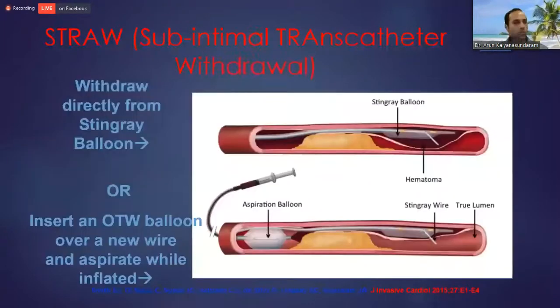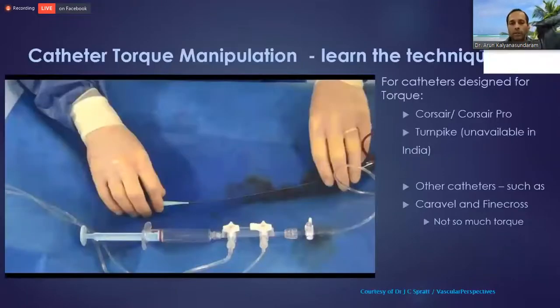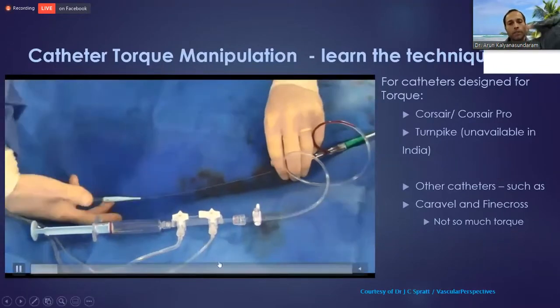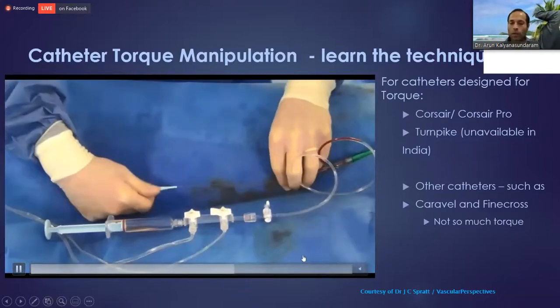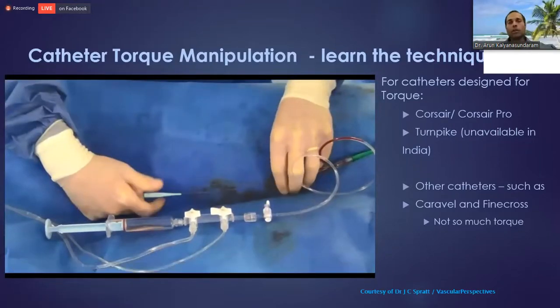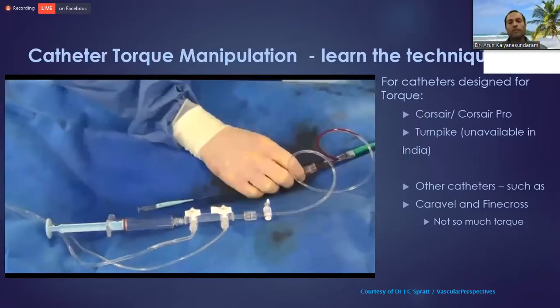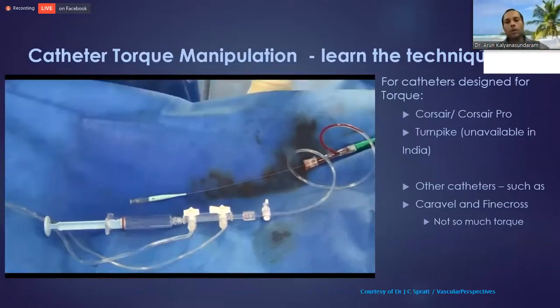So again, a straw is something if you have hematoma. But now, I do know that there are some retrograde operators. So I think it's important to know which microcatheters are torqueable and which are not. Understand that Corsair actually torques better counterclockwise, but you've got to go a couple of rotations, typically 5 to 10 counterclockwise, then go clockwise.